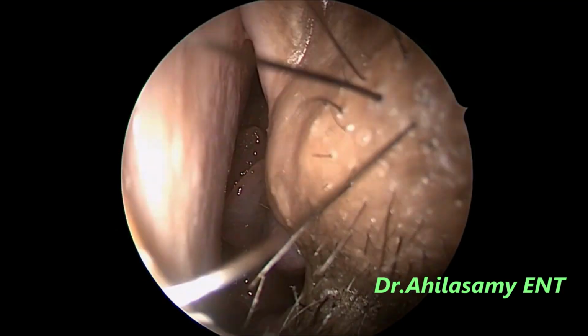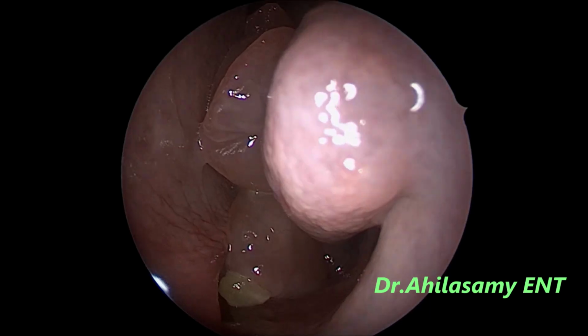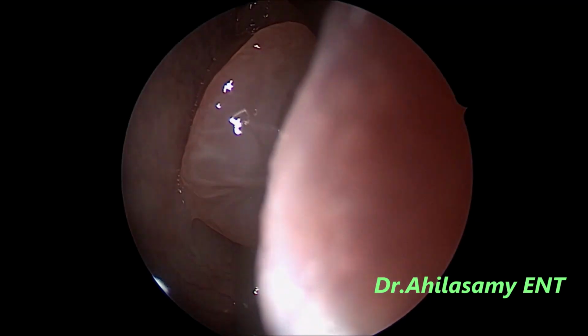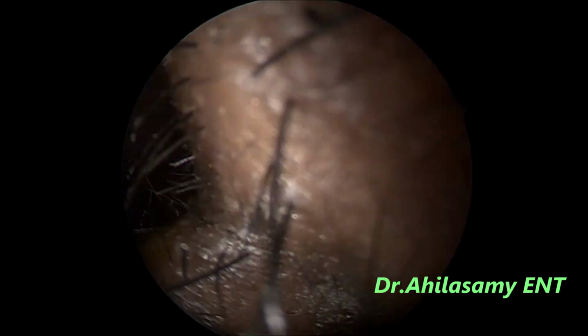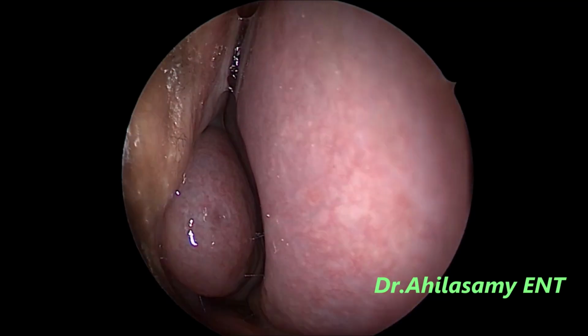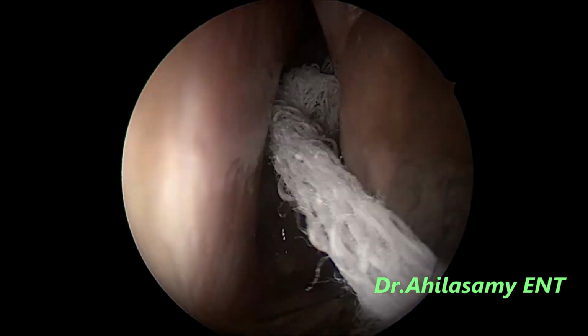See, this is the patient, this is a diagnostic endoscopy on the table, full of polyps. In fact, polyps were up to the vestibule. With 1 week of prednisolone, they have shrunk and gone back beyond the inferior turbinate on the left side, but anterior to the middle turbinate. Gross septal deviation to the right side, inferior turbinate hypertrophy, hardly can you see anything more.